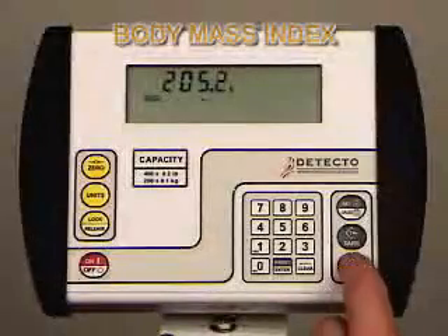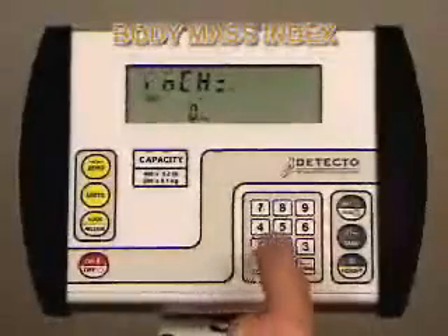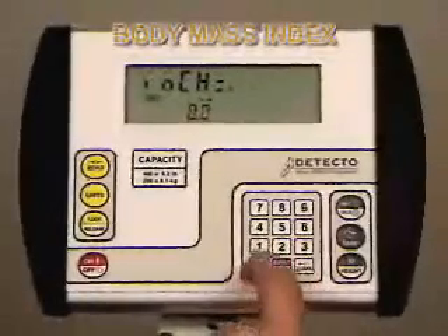Display Feet Mode. Enter the height of the patient in feet and press Enter. Then enter the patient's height in inches and press Enter again. It's as easy as that.